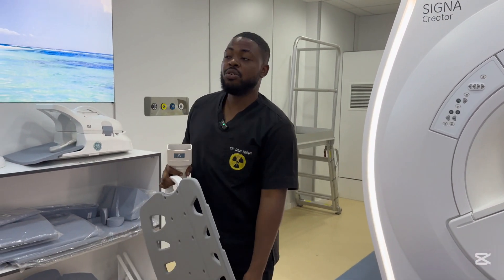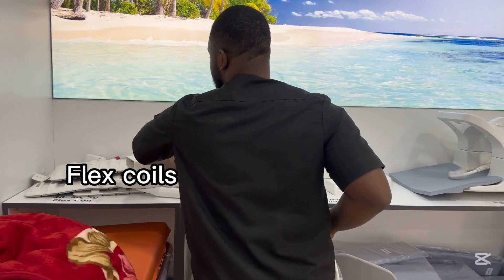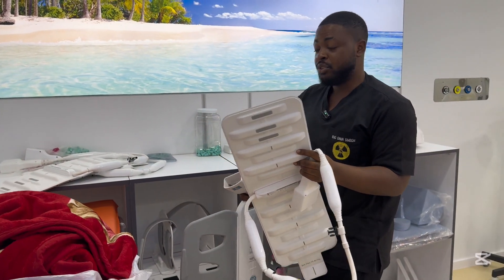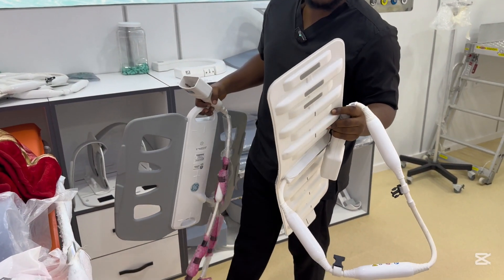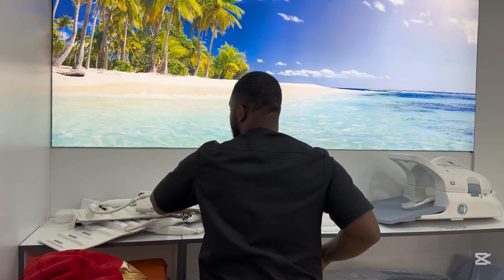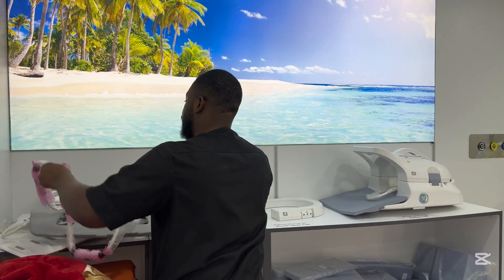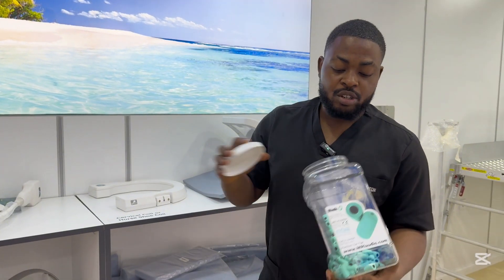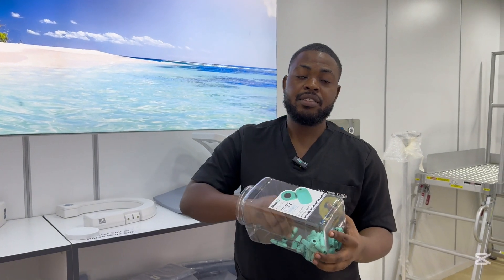Then we have flex coils of different lengths. We use them for joints — shoulder joints, elbow joints, wrists, knee, and ankle. There are about three different types. These are ear plugs — for each patient that comes in, we give them new ear plugs, and we switch them every time for every patient.